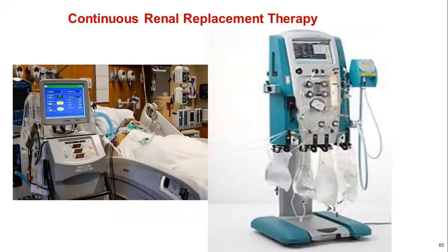So this is the machine we use for continuous renal replacement therapy.